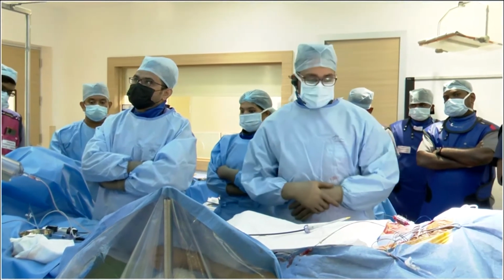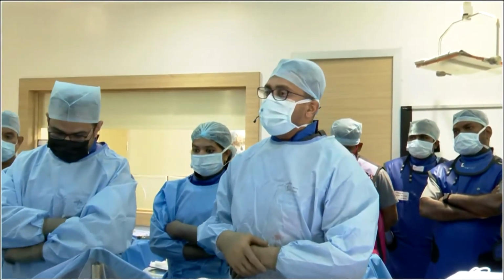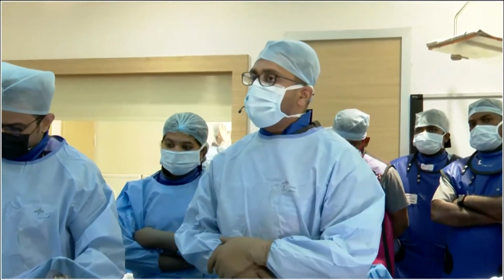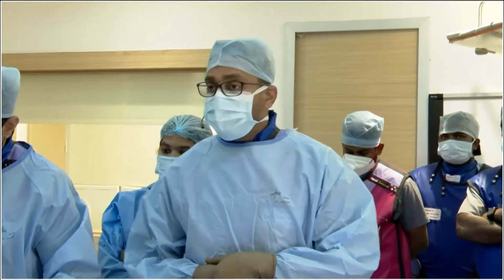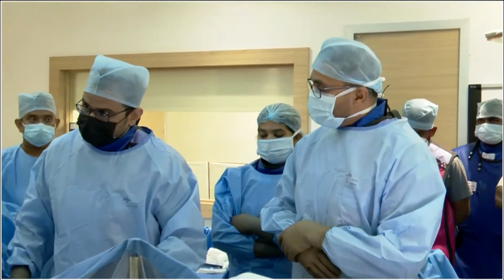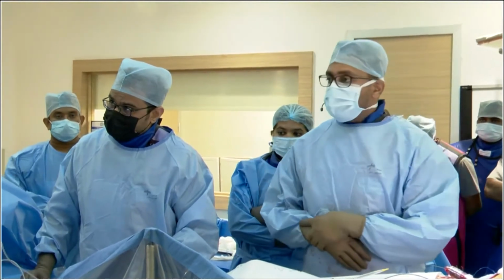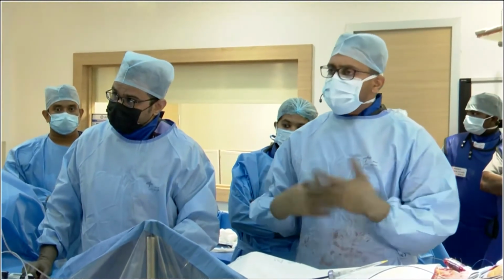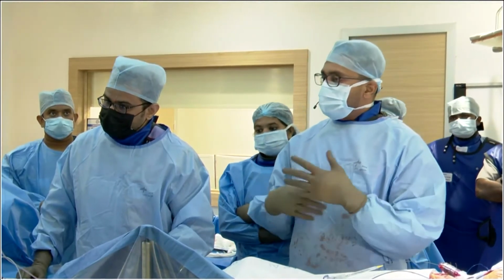Yeah, we are running. All right, great. So let's start the case. We've already done some basic preparations. The choice of valve, in this case, I have decided for a balloon expandable valve. And I'm choosing a Sapien S3 valve. And I feel balloon expandable is best for this patient and for most bicuspid. That's my preference. I'm happy to discuss that later.